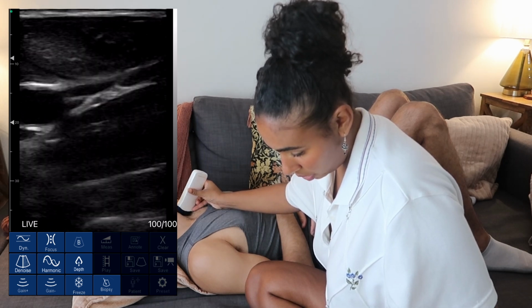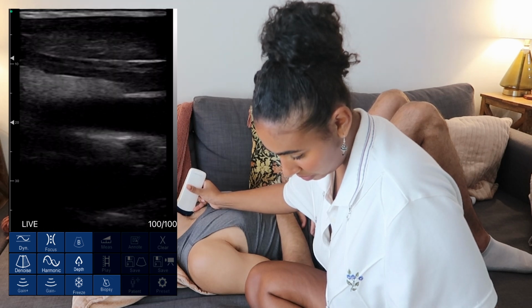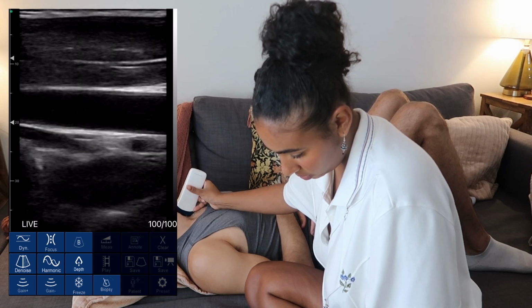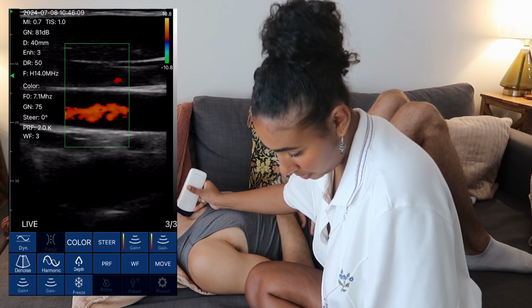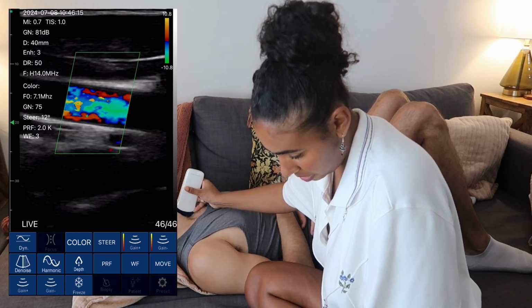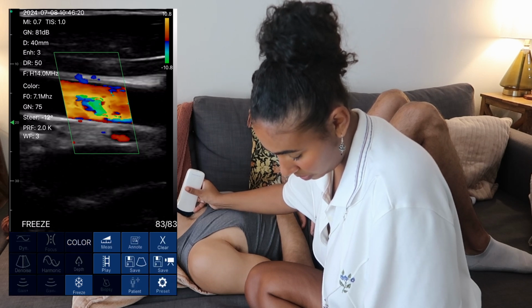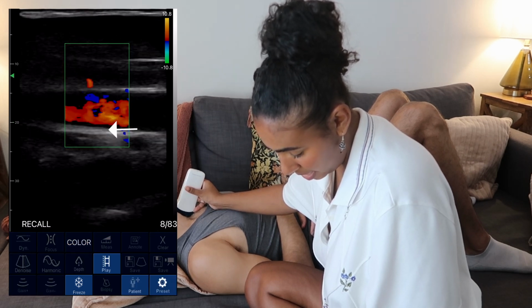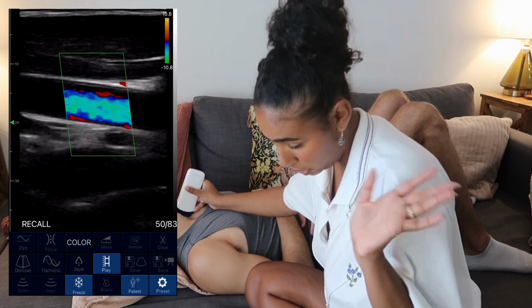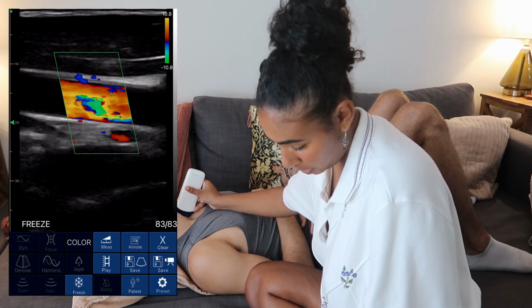And then we're going to go long on our carotid. And that's beautiful. Let's put some color on there. Steer our box. There we go. Freeze, and we can take that image. We can hit play to watch back the clip that we took. And this is us just watching it back. I'm not doing this part live. There we go.